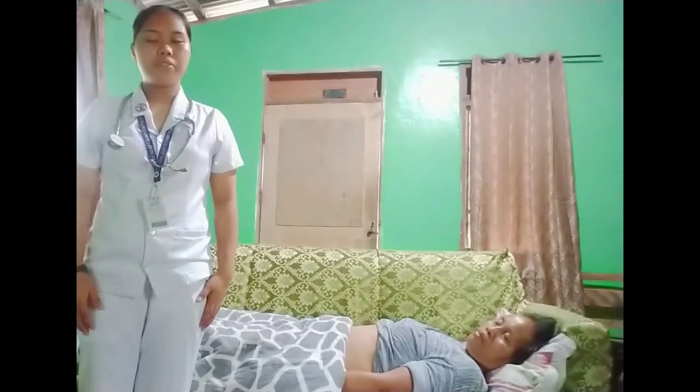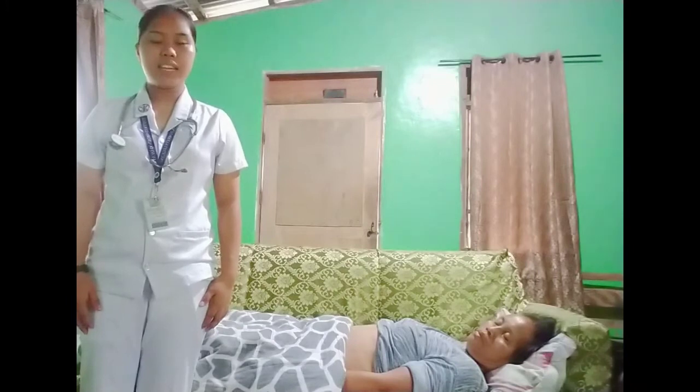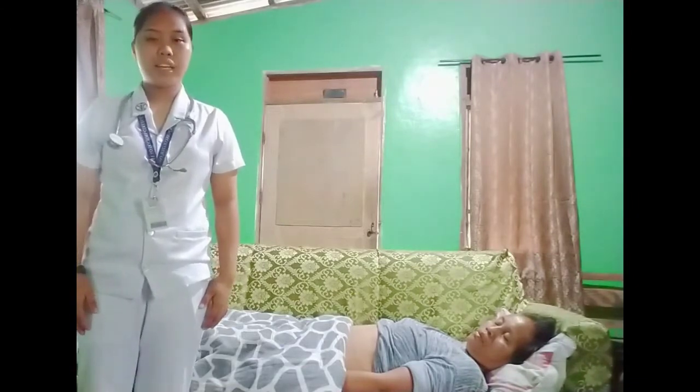Use the bell of the stethoscope to listen for the bruits, and also auscultate for the venous hum. Use the bell of the stethoscope to listen for the venous hum in the epigastric and umbilicus areas. Auscultating for the vascular sounds is especially important if the patient has hypertension.